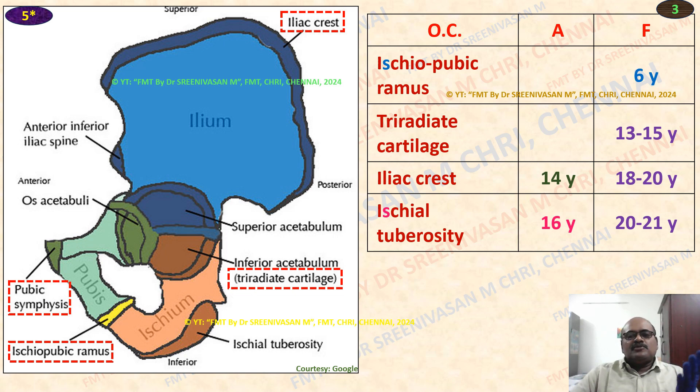Generally, pubic symphysis also appears similar to iliac crest at 14 years, with fusion at 18 to 20 years. Generally it cannot be viewed better in the X-ray, so we can skip this. Whereas the remaining four ossification centers are important.